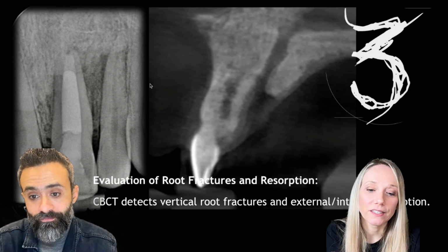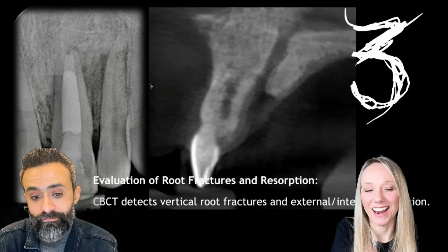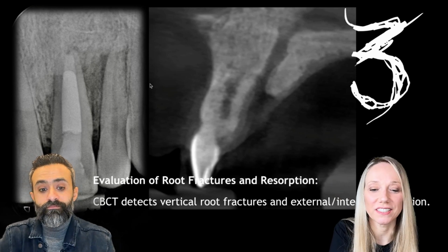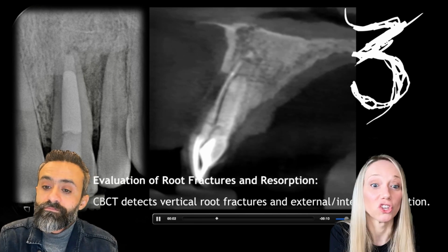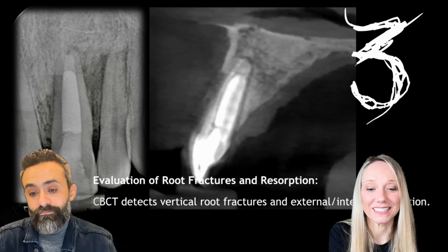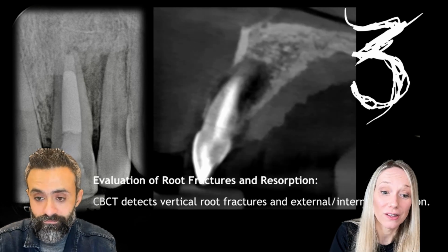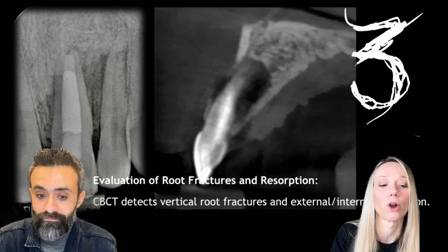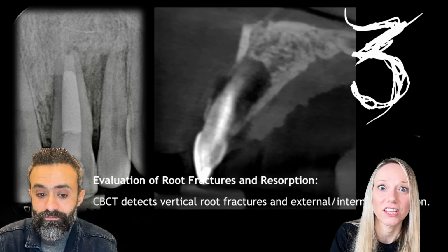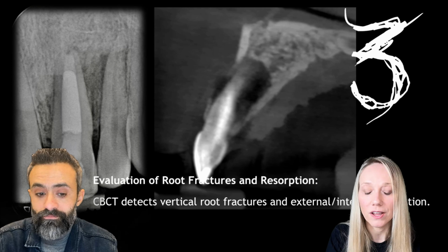Well, yeah, but you don't have to think that you can always see the fracture, because you can see it only in cases in which the fracture is huge. For example, in this case, the tooth is split in two. So yes, I can see the fracture, which I could not notice from the X-ray. From the X-ray, I could only see that there was some problem. But to assess the nature of the problem, of course, I had to investigate more.